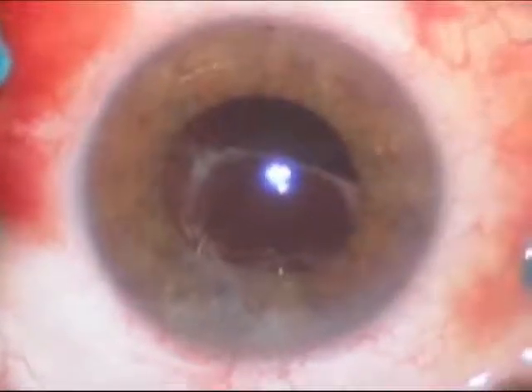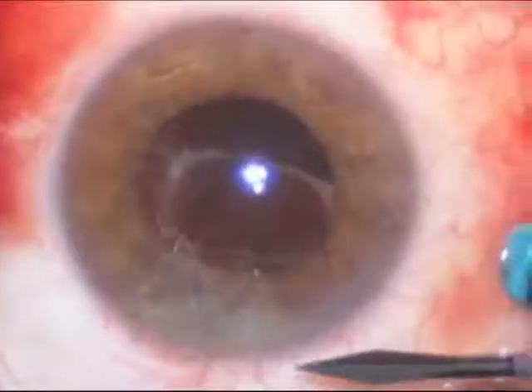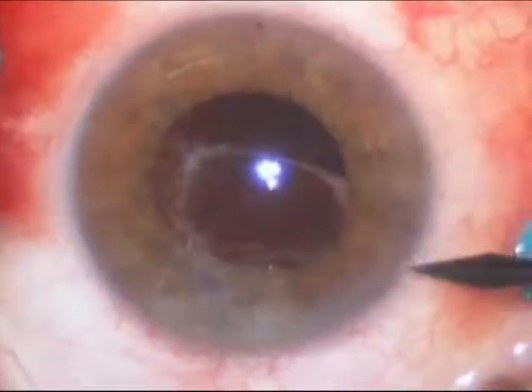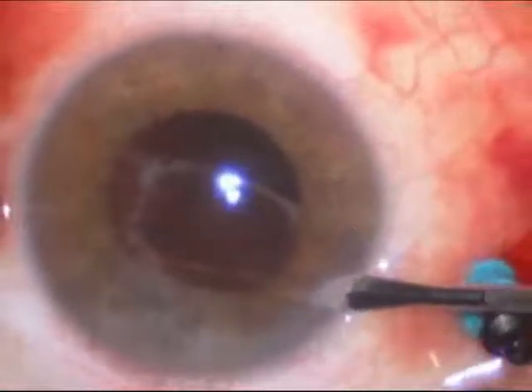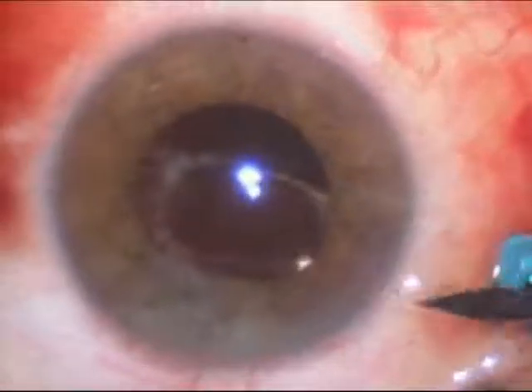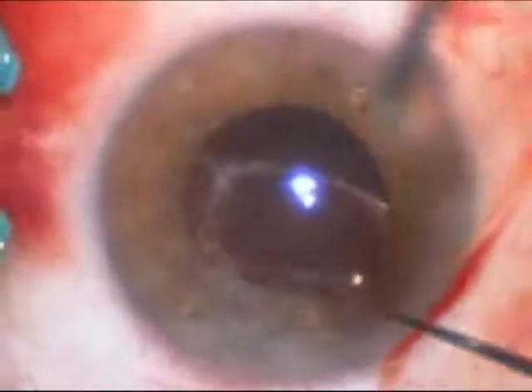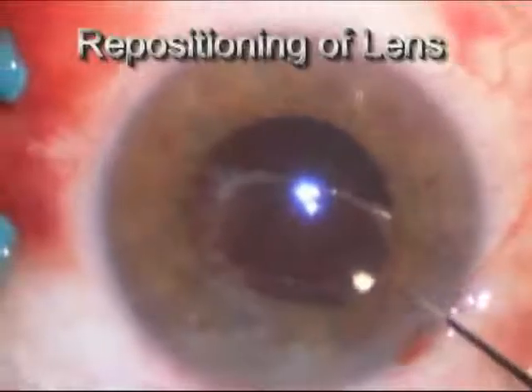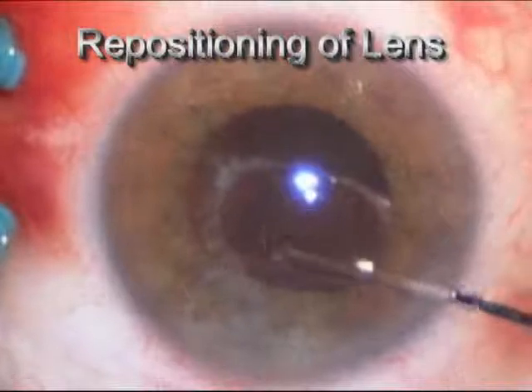After removing the macular pucker, a very small incision is made in the cornea, and that's used to manipulate and recenter the intraocular lens. The haptics, which are the two little springs which hold the lens in place, are frozen inside the capsule. It takes a fair amount of force, as you'll see here, to hook the lens and to reposition it into the center of the pupil.